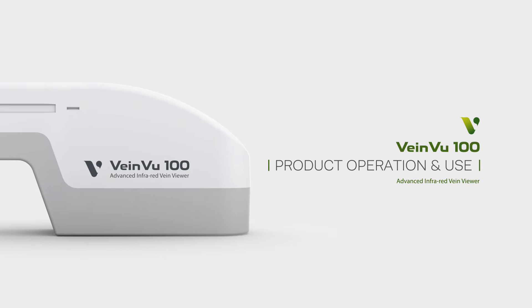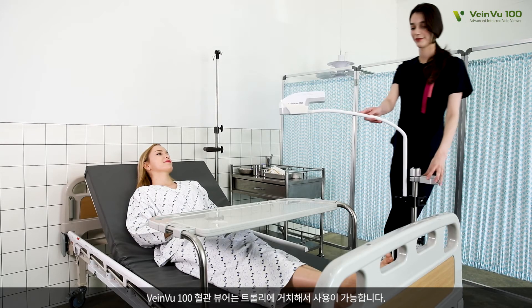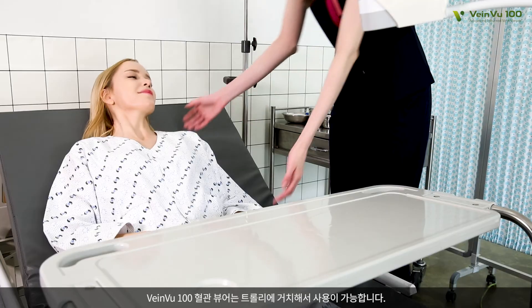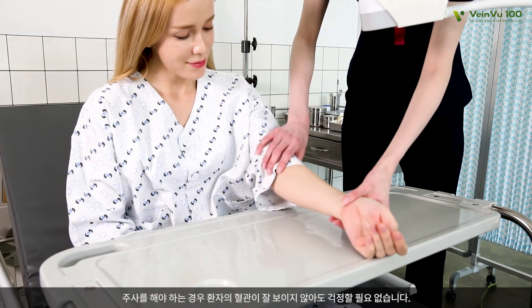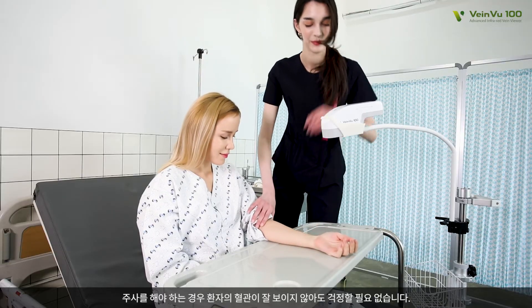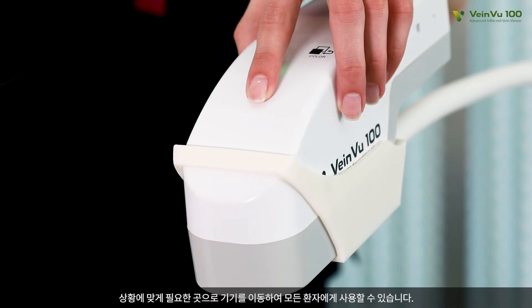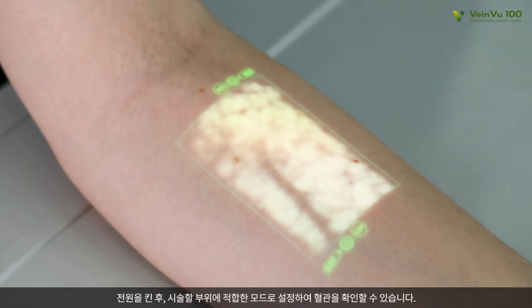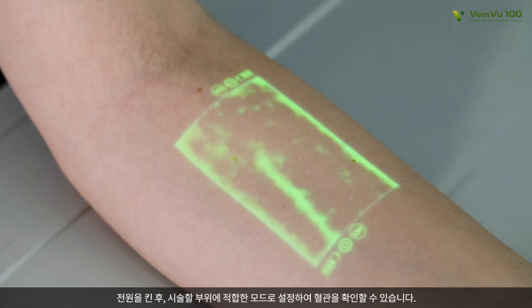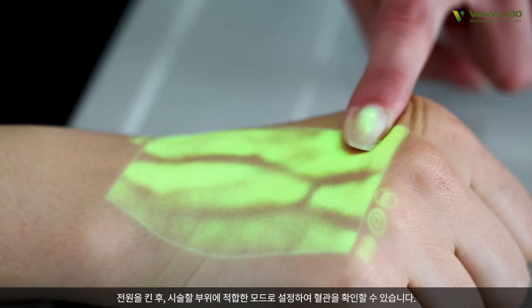Product Operation and Use. To use VeinVu 100 Transilluminator, put it in a trolley. When giving an injection, you need not worry it is hard to find a patient's vein. Move the device to the patient and find his or her vein to operate. Change the mode in which a vein is observed well from a view of medical staff, and then start to operate.